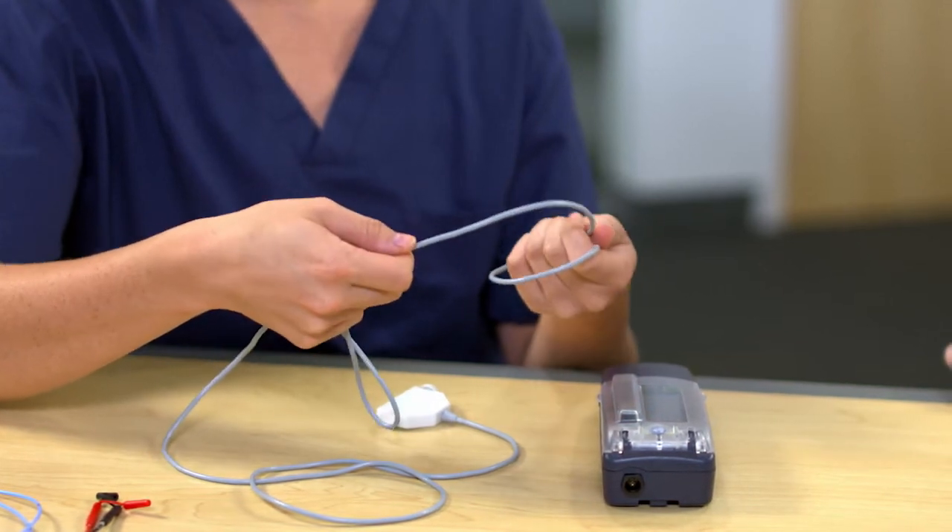How long can these cables be used? Great question, Kristi. The disposable cables may only be used one time. The reusable cables may be cleaned and reused. Be sure to check on your institution's policy on sterilizing and reusing cables.